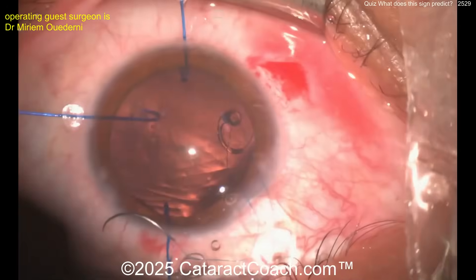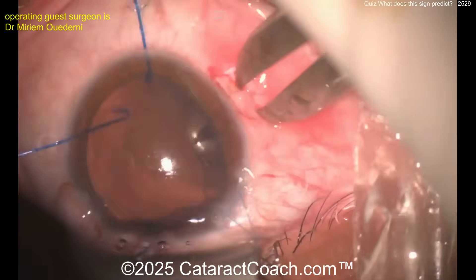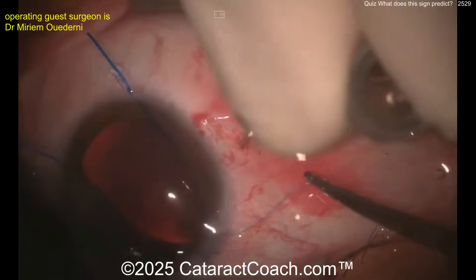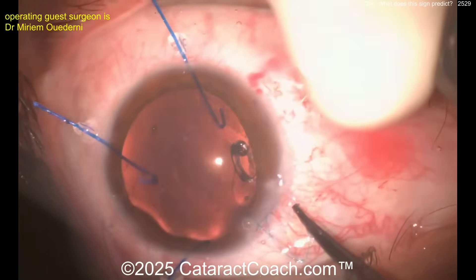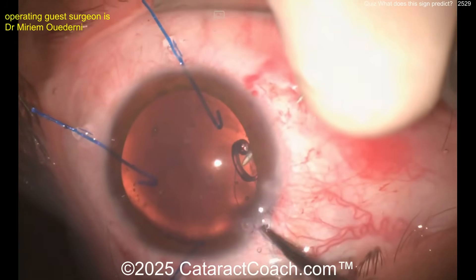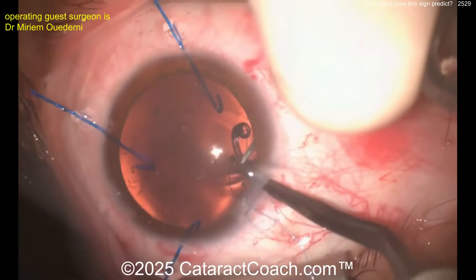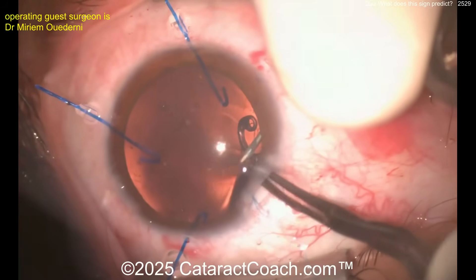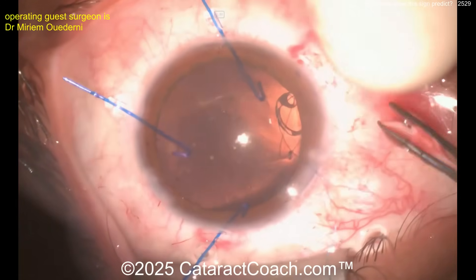The surgeon is positioning that eyelet above the capsulorhexis, making some marks, creating a little groove. Passing the 10-0 polypropylene through — here's a hollow bore needle to help guide it out. Get that polypropylene suture in there, and then once you pull that out and get both ends out, you can tie a knot and bury it. Placing the suture itself inside that hollow bore needle to guide it outside through the sclera transclerally, and once you get both ends you can tie it down.